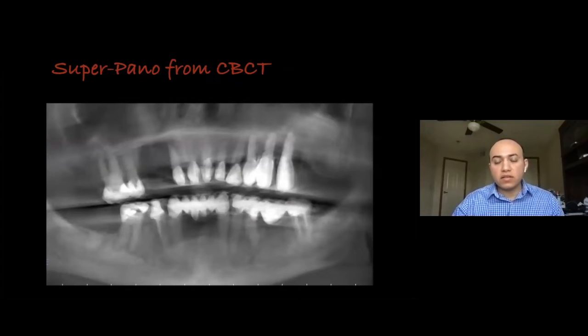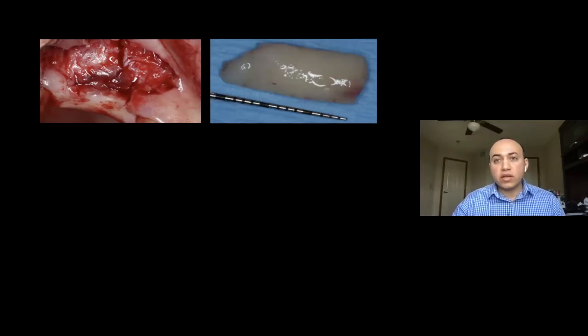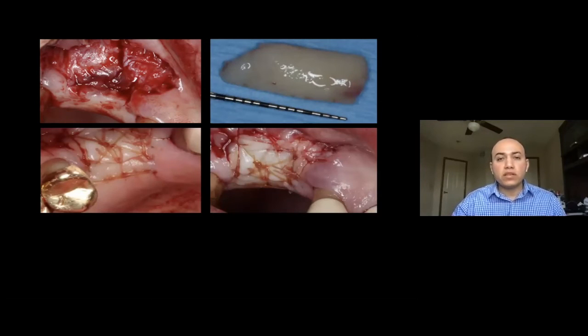In this case, I did it back when I was in residency, and for me it was a very complicated case. But when you break it down step by step and fix each problem one at a time, you will see how we're gonna reach a very good result. So look at the area. There's just a split thickness flap. You can see how the tissues are very inflamed, and this is all granulomatous tissue from the failed implants that fell off. This is a large tuberosity graft that was taken and placed at the edentulous area after we did the split thickness, and then we used chromic gut sutures to stabilize the graft.